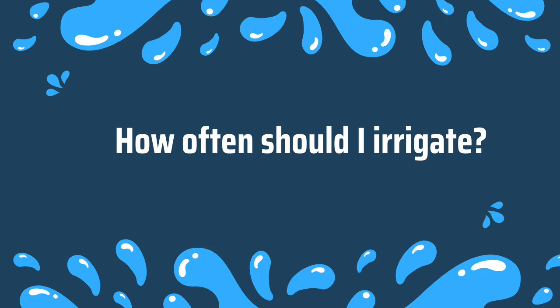How often should I irrigate? Well, during the initial 10 to 14 days, most ostomy specialists recommend irrigating daily. But once you feel confident with the procedure and your output stabilizes, you may find you can irrigate every other day. Every individual is different. Some people need a few weeks to fully grasp the process and feel comfortable with it. And additionally, some people may take several weeks for their body to achieve the predictable bowel pattern with colostomy irrigation.